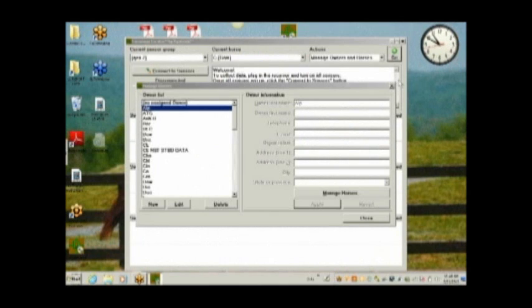And lastly, we'll just quickly go through generating an analysis from previously collected data. So for instance, if you had saved your data but you hadn't run a report on it right after collecting your data, you can go back into your list and choose the data that you'd like to run an analysis on. Or you can rerun an analysis, perhaps changing parameters. Perhaps you want to change the selection of strides or throw out outliers, etc.